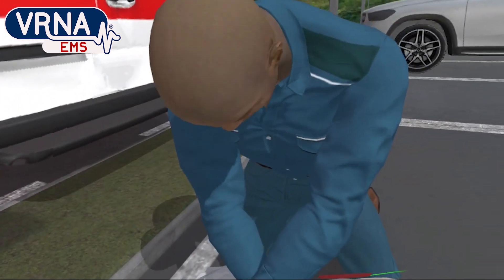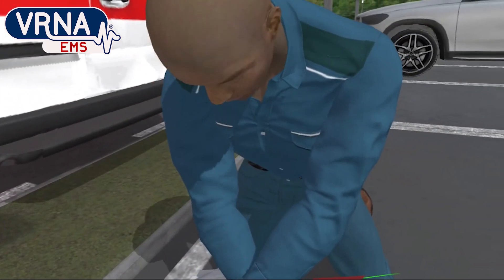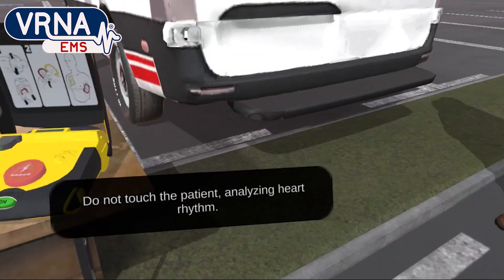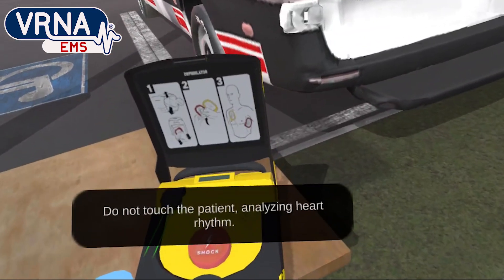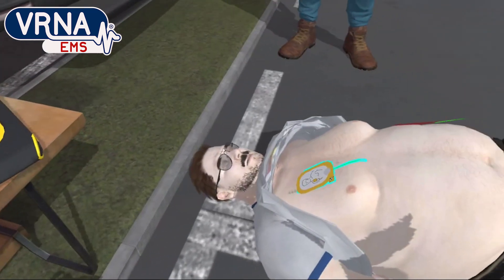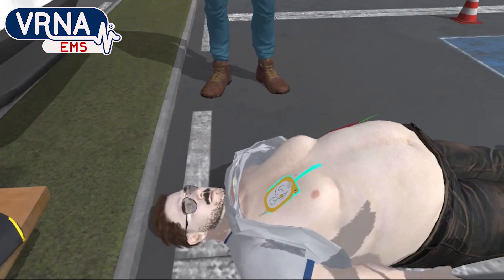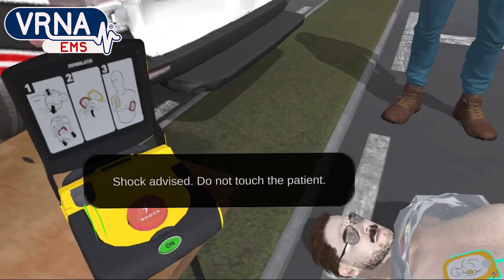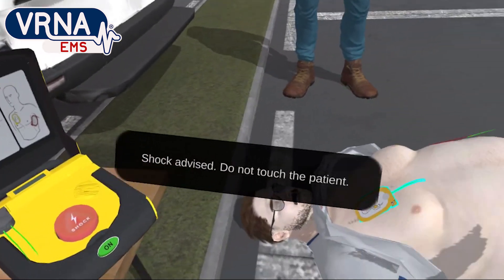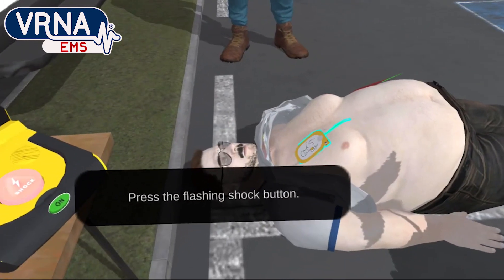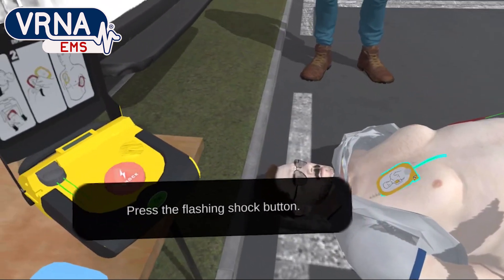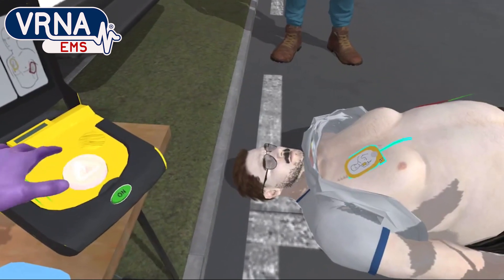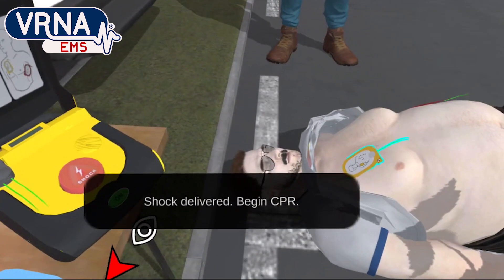Josh, stop doing CPR and don't touch the patient. Analyzing heart rhythm. Shock advised. Do not touch the patient. Press the flashing shock button. Shock delivered.